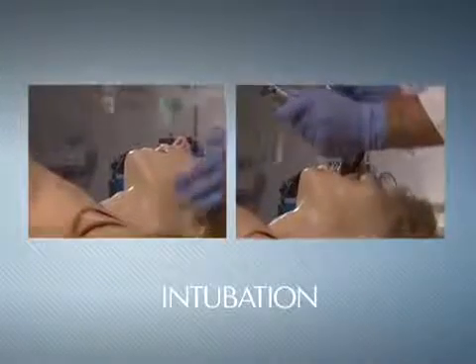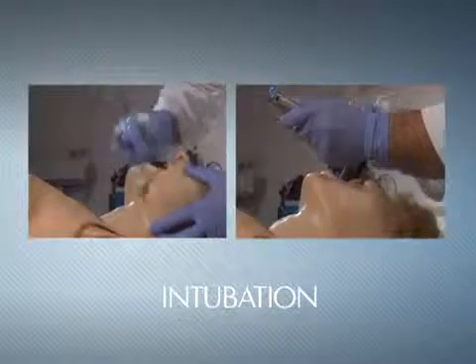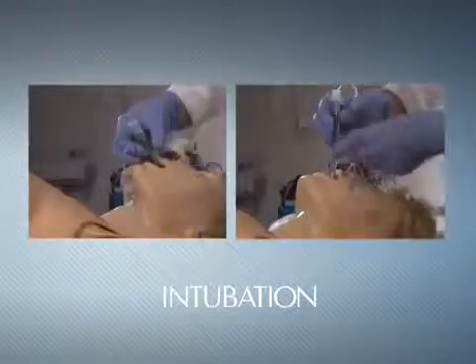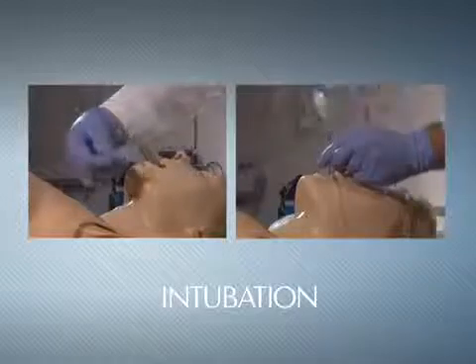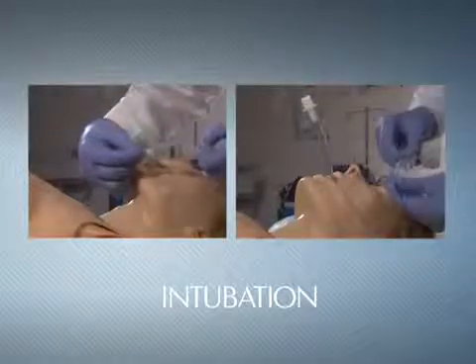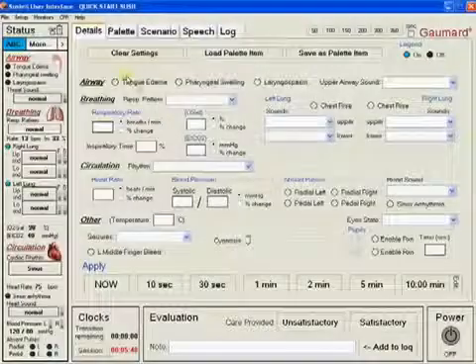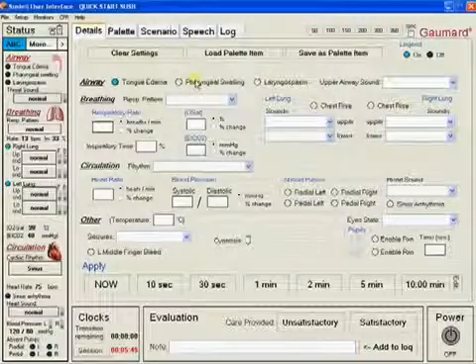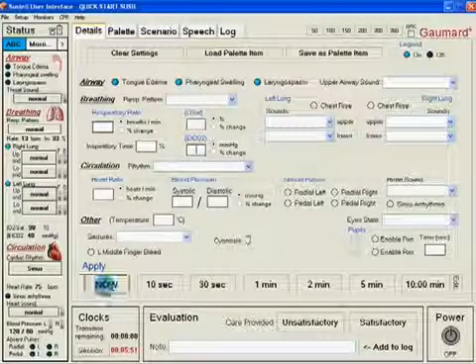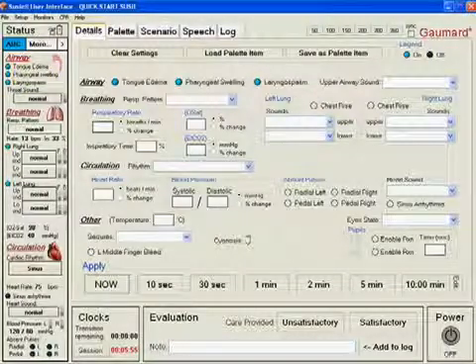Suzy's airway can be intubated both nasally and orally using LMA or an endotracheal tube. She can also be used for gavage and lavage procedures. Intubation can be made more difficult by turning on pharyngeal swelling, laryngospasm, and tongue edema.